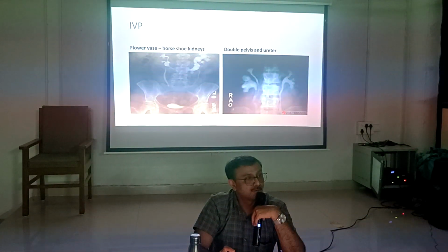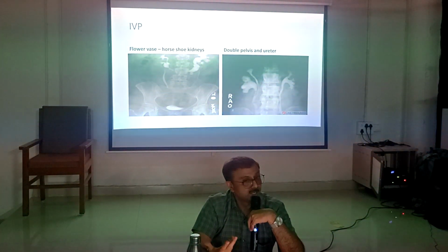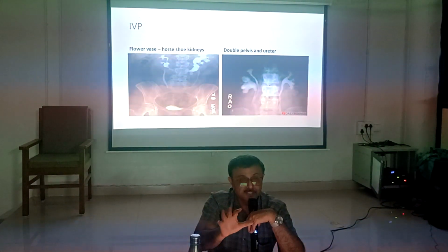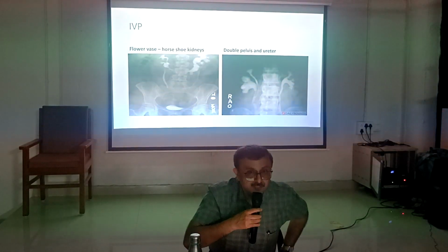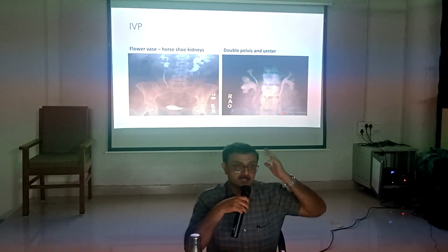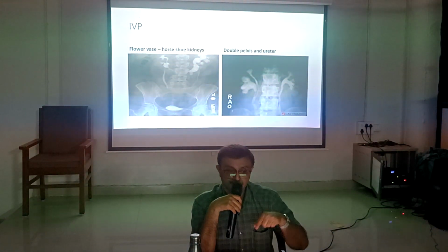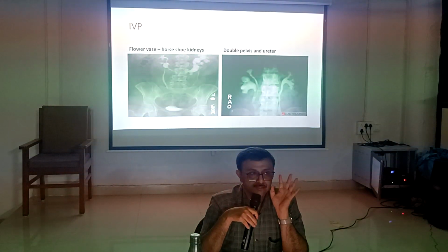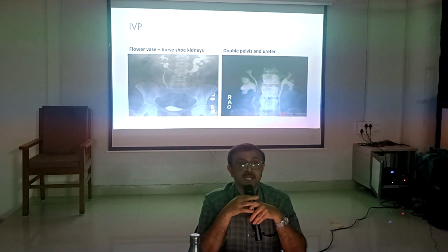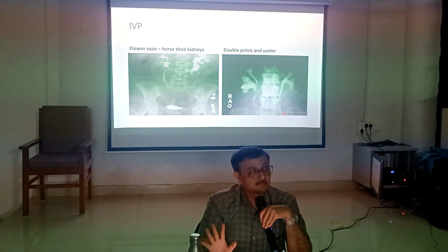So the single kidney was removed. There was an absent kidney, and ultrasonography did not show it. This is the importance of radiological investigations and anomalies: if we don't think about anomalies, we can't see them, and surgery can remove the only kidney which was functioning. It is a very old incident from Gujarat.